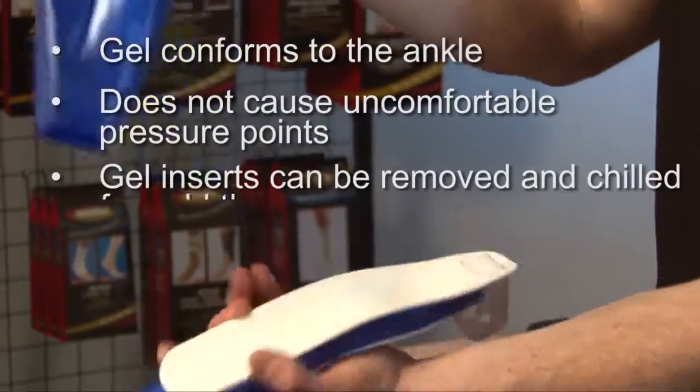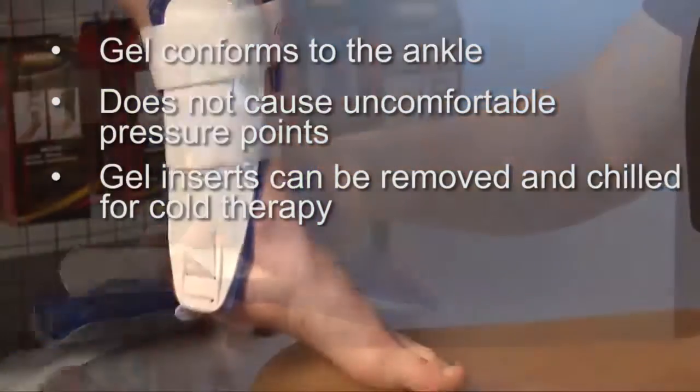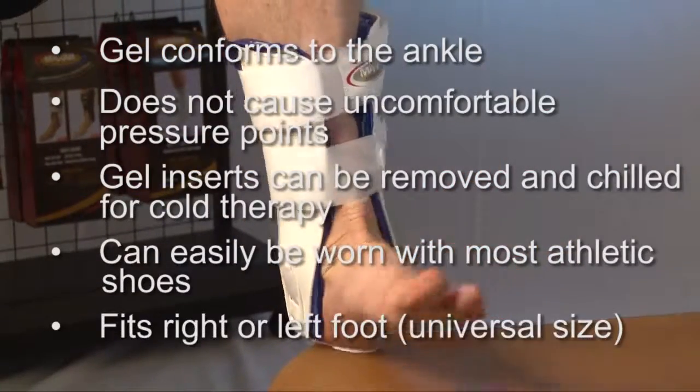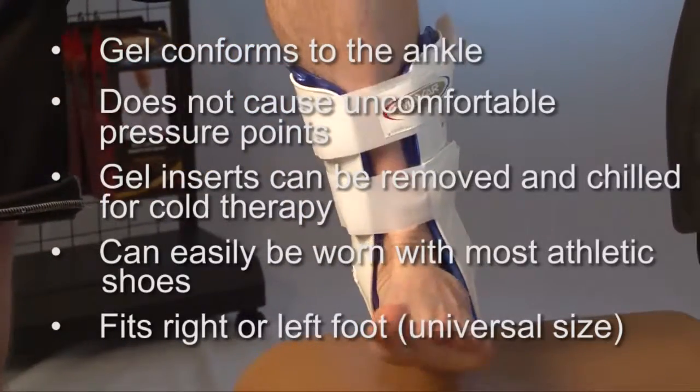The gel inserts can be removed and chilled for cold therapy. It has a slim profile so it can easily be worn with most athletic shoes, and it fits on the right or left foot — it's a universal size.